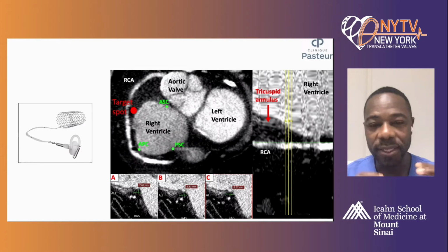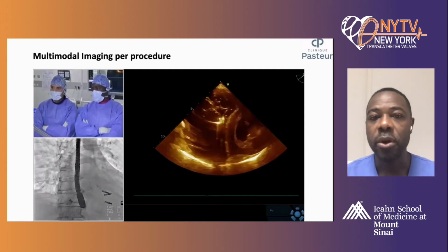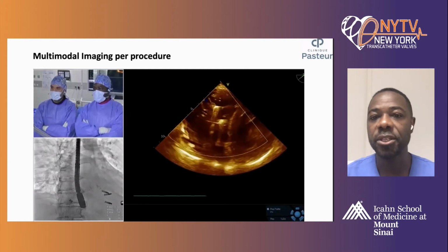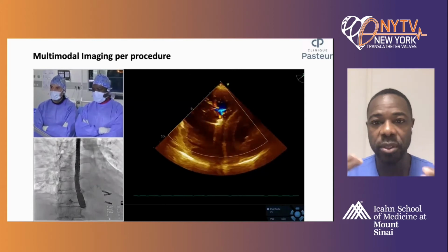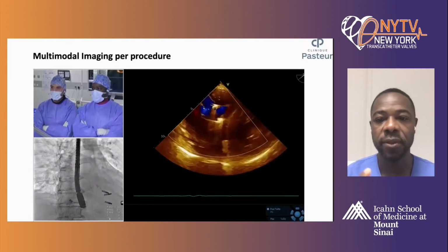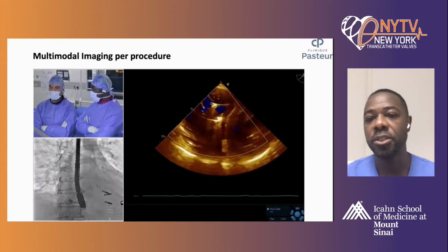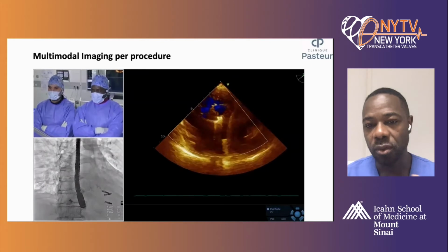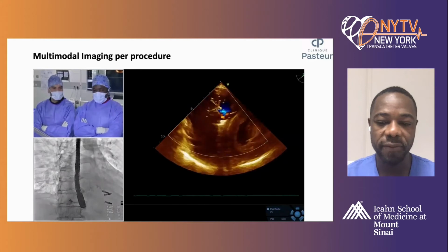So this is the overall integration of the tricuspid valve and the surrounding structures. During the procedure, you're going to see that more and more often. It's another multimodal assessment, multimodal imaging to guide the procedure and the deployment of the devices that we're going to use. We need to combine, as is the case for example for the TriClip, the echo imaging and the fluoro imaging, and this is meant to really guide us towards the location of the jets and to navigate through the various structures before reaching the tricuspid valve.